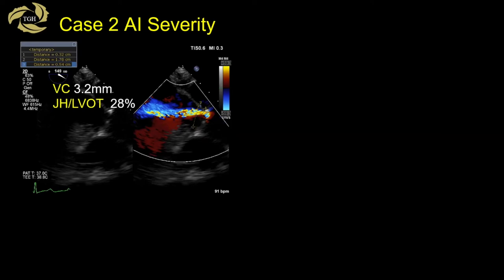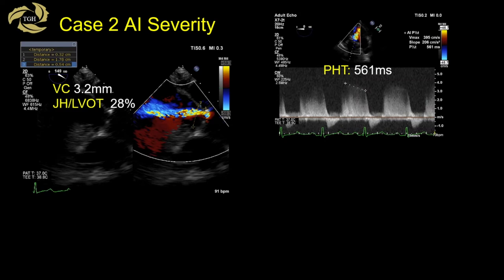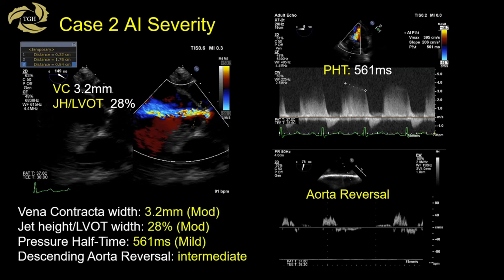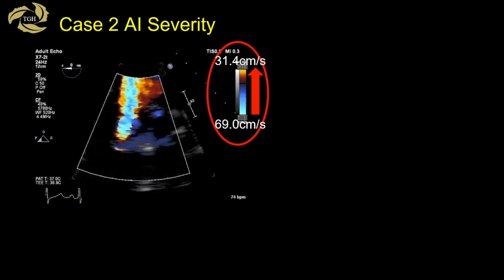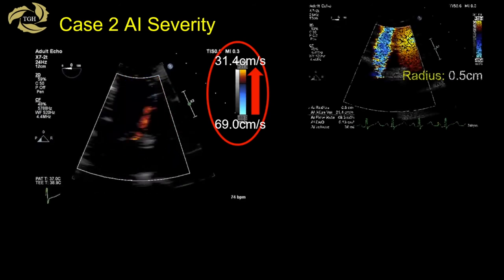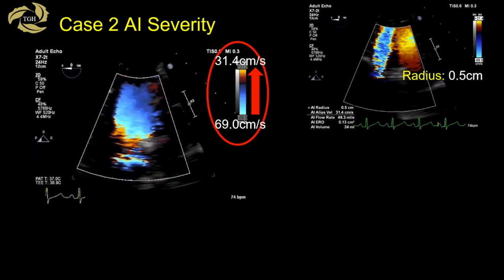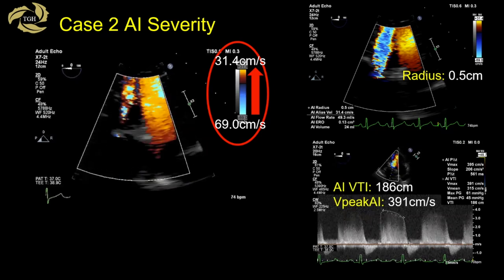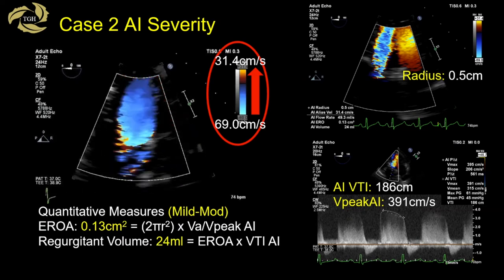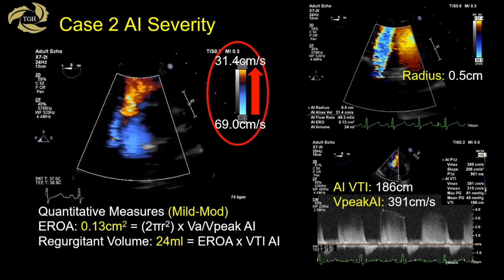For AI severity in Case 2, the vena contracta is 3.2 mm and the ratio is 28%. Pressure half-time is 561 ms, and there appears to be mild aortic flow reversal — these indicate mild to moderate AI. PISA is more difficult with less AI as error tends to increase, but quantitative measures confirm mild to moderate AI: EROA 0.13 cm² and regurgitant volume of 24 cc.